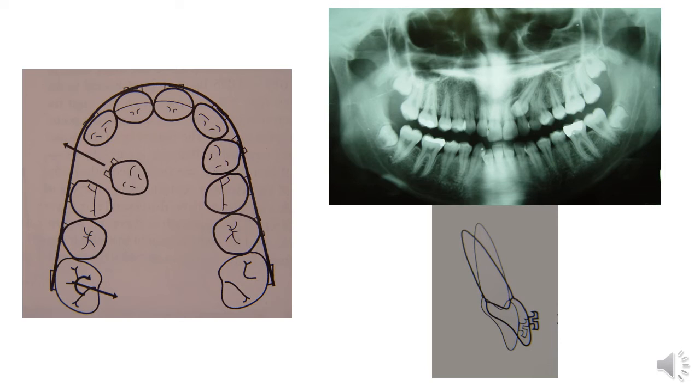You don't have enough space to bond the bracket 4 or 5 millimeters from the incisal edge, and depending on the surgical exposure of the canine, the bonding position is usually more incisal, and after the tooth gets to its proper position, you need to make lingual crown torque, like this example.